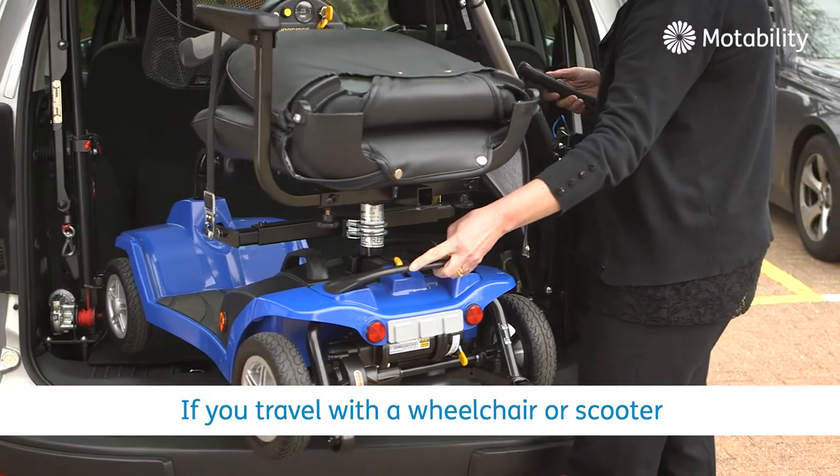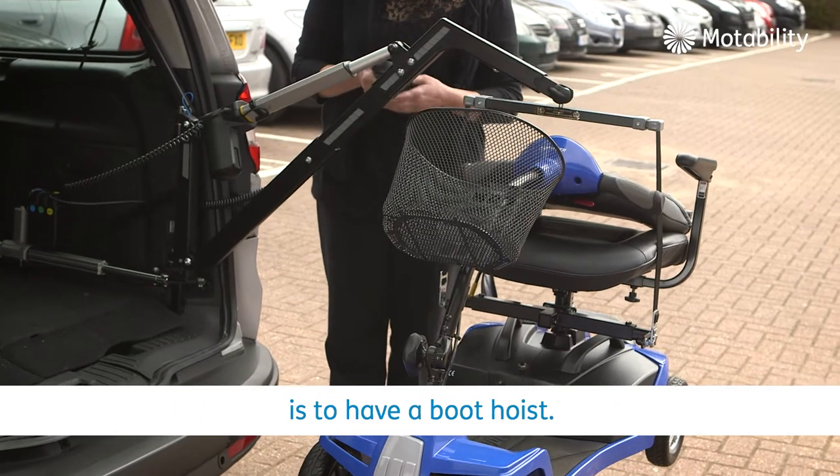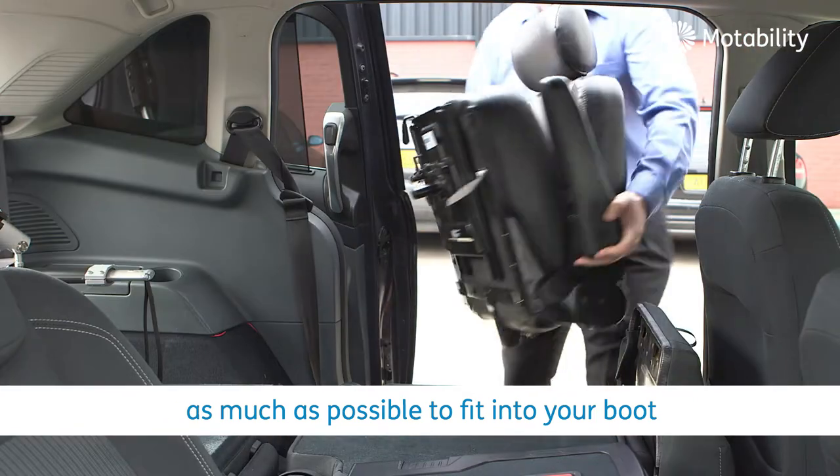If you travel with a wheelchair or scooter, the best way of getting it in and out of your car is to have a boot hoist. You may need to dismantle your scooter as much as possible to fit into your boot.